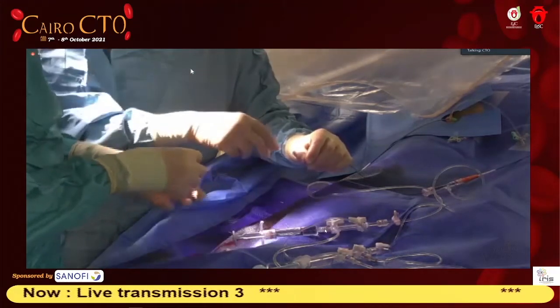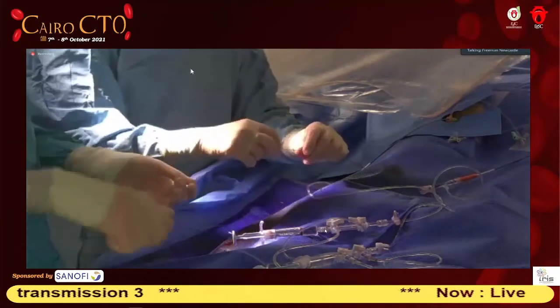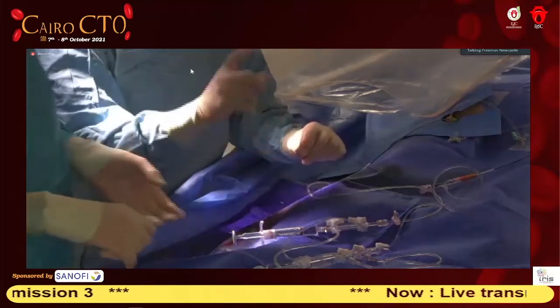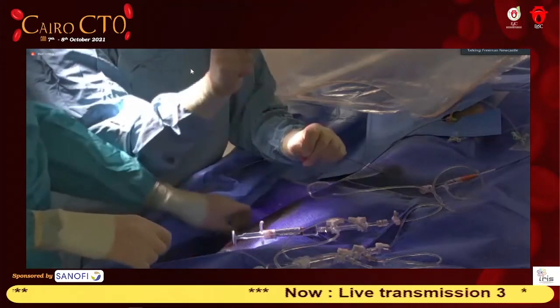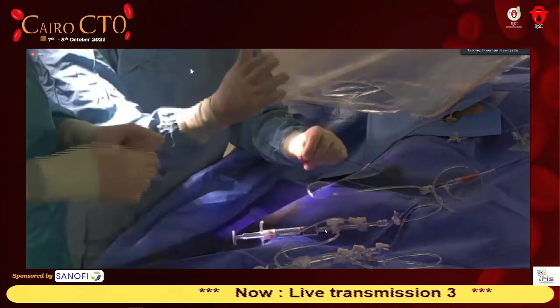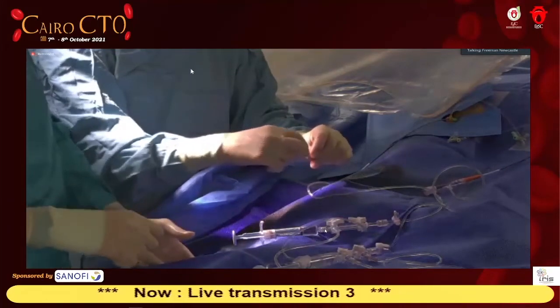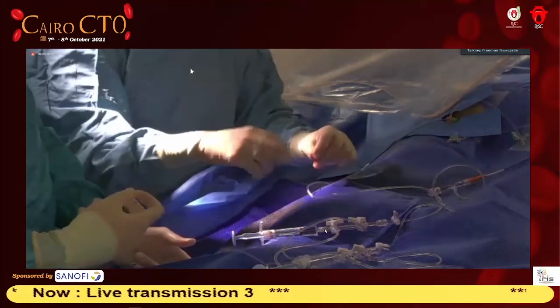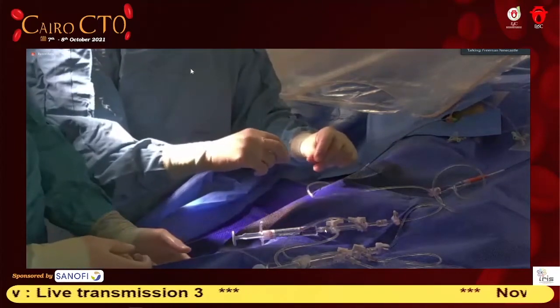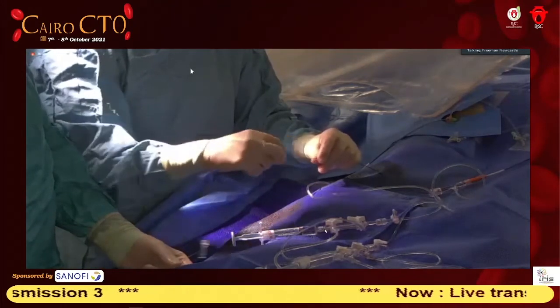This one was used in the neuro intervention. Not this one. No, this one is big. So the neuro intervention, that's why I was saying, they are very thin coils, so you could use the microcatheter. If you're down with the FineCross or with the Corsair, the thin neuro coil can be used through that. With these kind of coils, the Vortex, they don't.